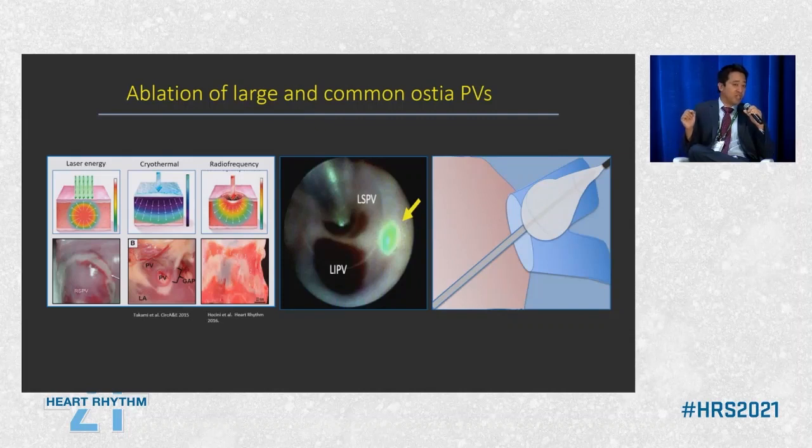You've seen it with the electrograms changing, or your catheter can be stable, but the heart can move underneath your catheter. Depending on the location, it may be more hostile to get a stable lesion. But if you want to do a WACA, then you're dealing with thicker tissue, right? And it's harder to be transmural.